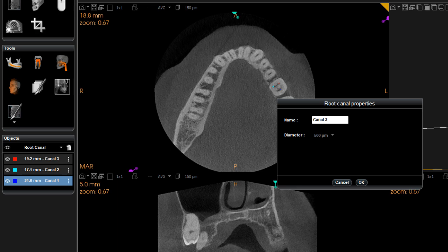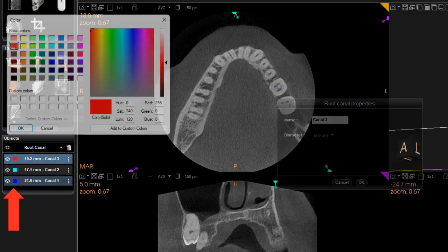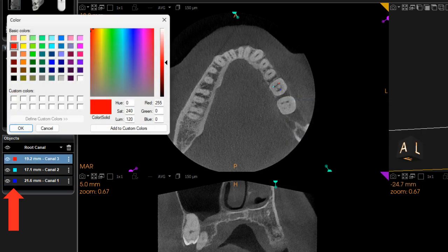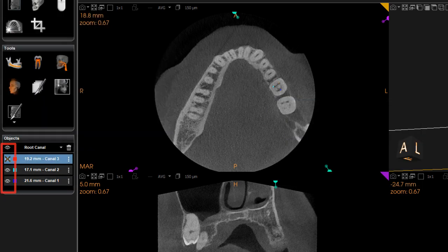If edit is selected, you can change the name of the tracing and the diameter. Click the color box to change the color of a tracing, or the eye icon to hide or show a tracing.